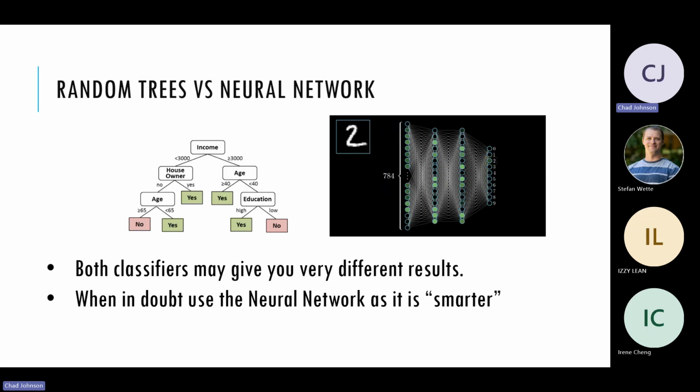The second, more advanced way is to use a neural network, which is designed very similar to the human brain, where you have a lot of interconnecting nodes, which can then make decisions based on the input. Typically with most neural networks, you have an input layer, an output layer, and a hidden layer, or multiple hidden layers. The input is the data that it sees.